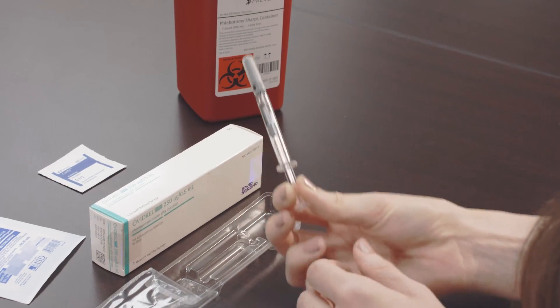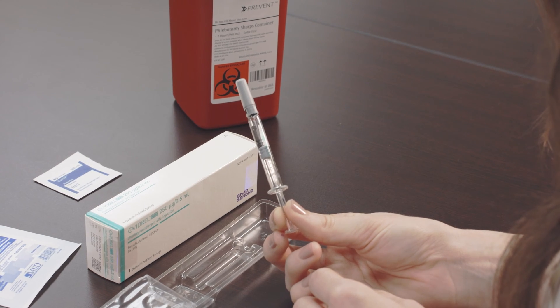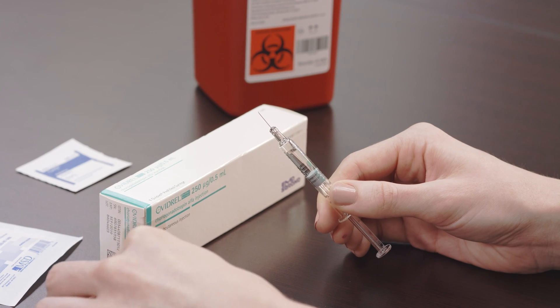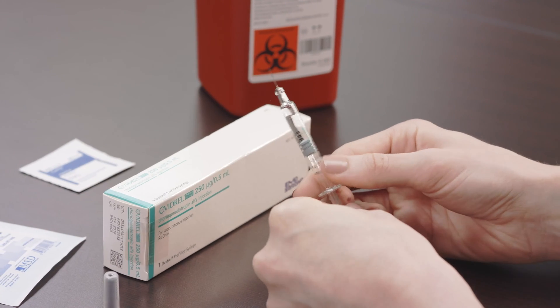Remove the pre-filled syringe from the plastic holder. Hold the needle upright and remove the cap. Don't let the needle touch anything, including your hands.